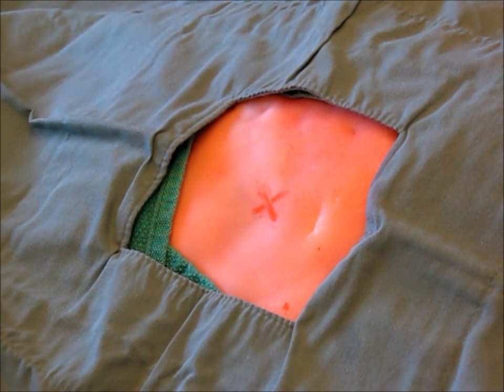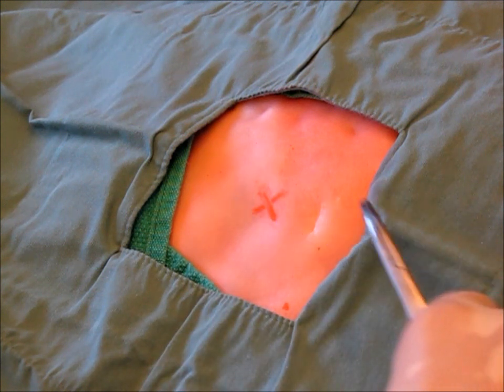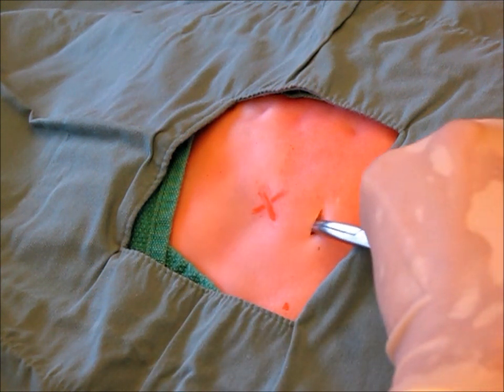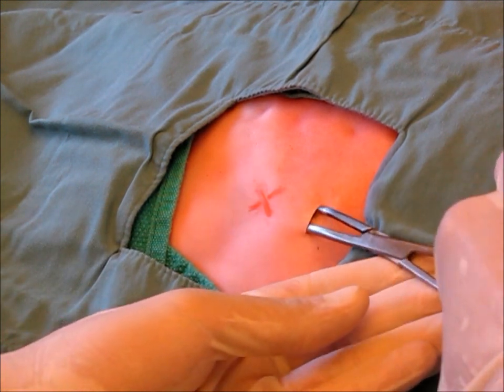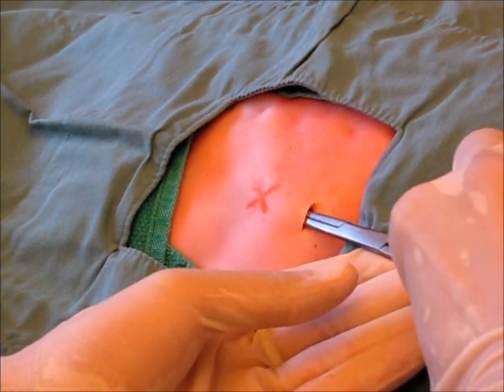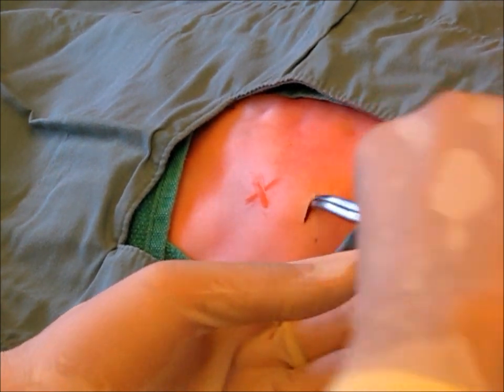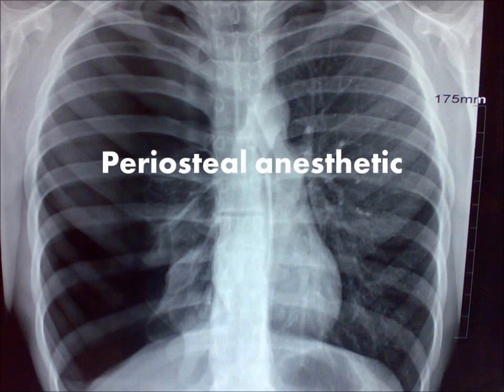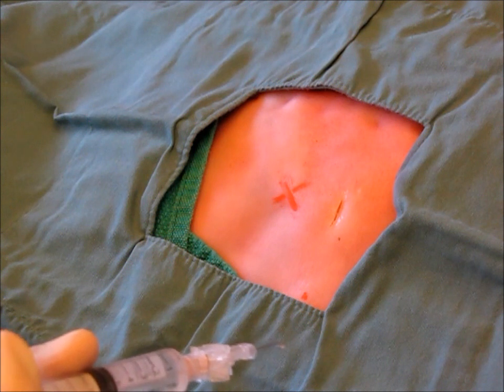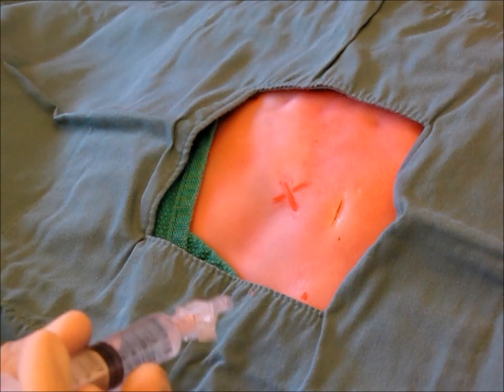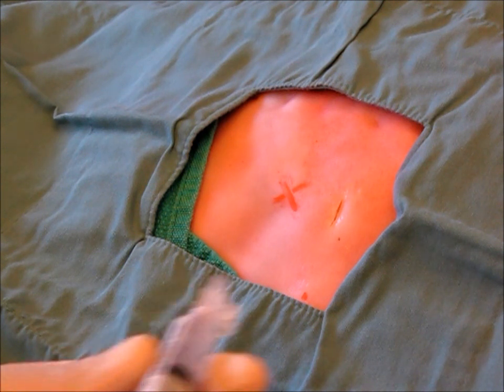Then, using a kelly, blunt dissect through the subcutaneous tissue, cephalad toward the desired intercostal space, being sure to always use two hands to stabilize the kelly. At this point, local anesthetic should again be infiltrated into the inferior and superior periosteum, the surrounding musculature, and the parietal pleura.